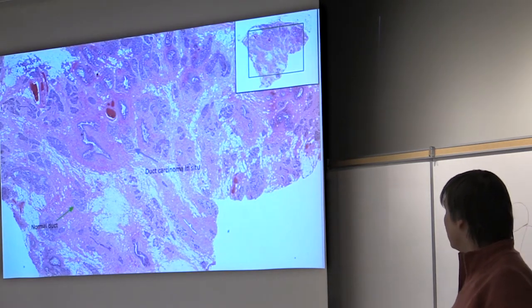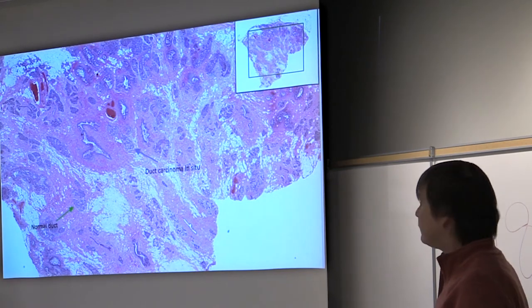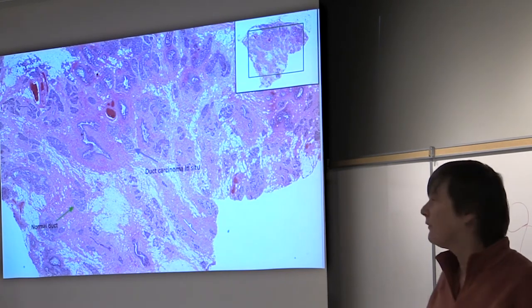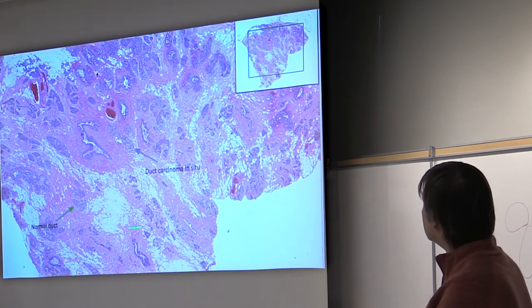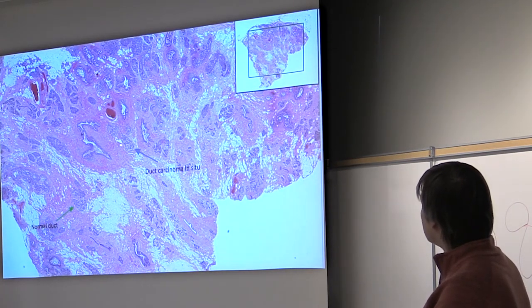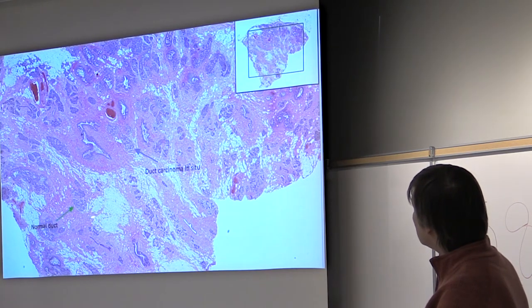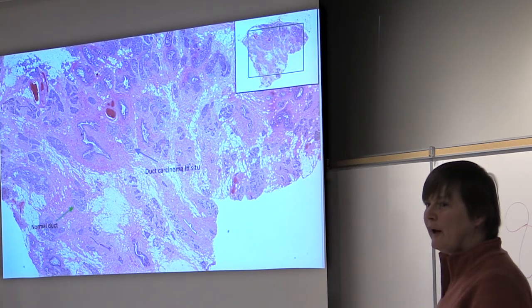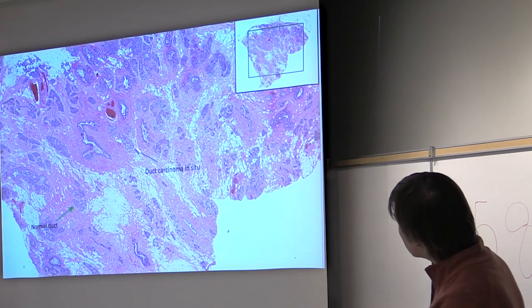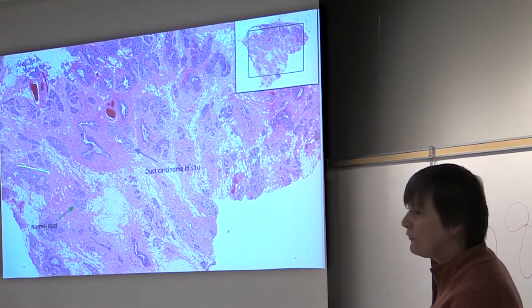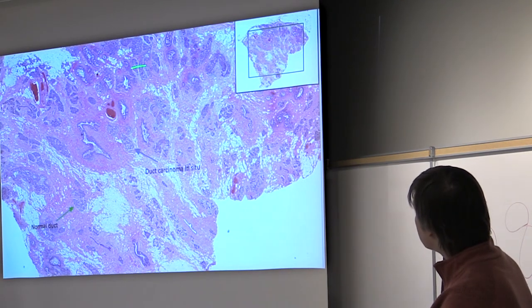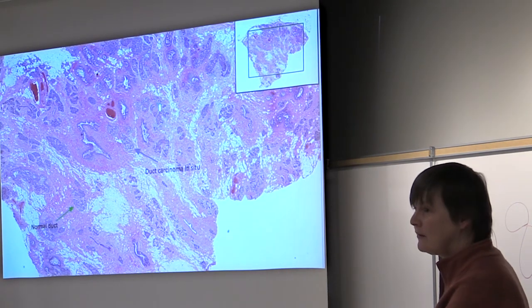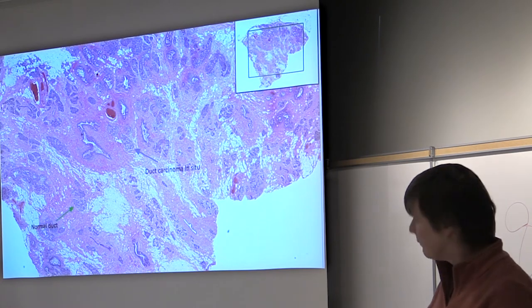Here's an example: a project on ductal carcinoma in situ, a non-invasive form of breast cancer. This is breast tissue excised at surgery — the patient has DCIS, with one labeled here, but there are also normal breast ducts. At this resolution I challenge anyone to tell which is which. You need the low resolution to see context: where the ducts are, what the heterogeneity is like, how many there are, and so on.